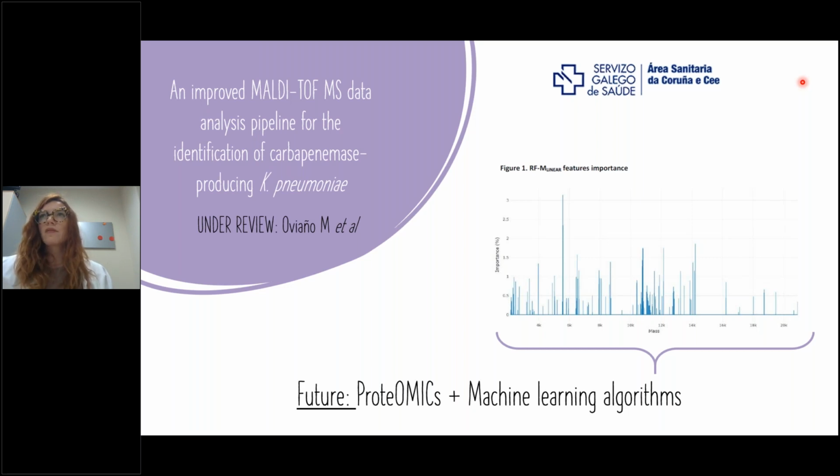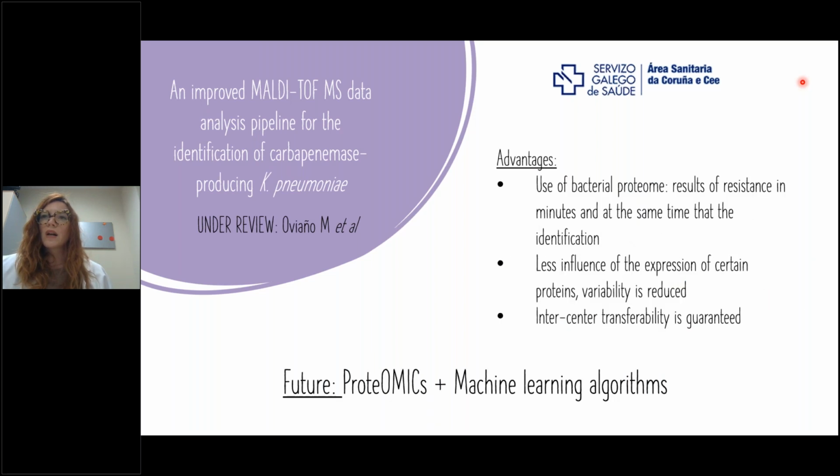I think from now on it will be key to use proteomics with machine learning algorithms. Caroline will talk about it later, but I think this will really be the future of MALDI-TOF, especially in antimicrobial resistance detection.